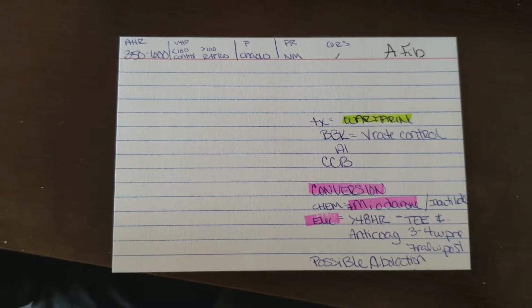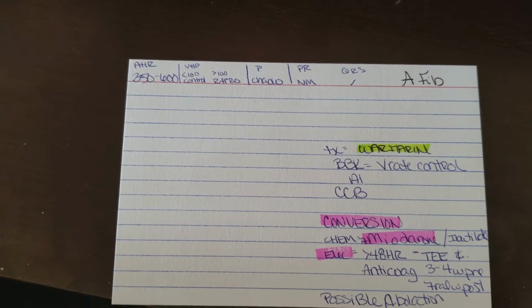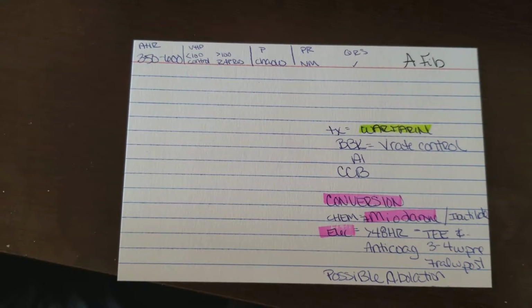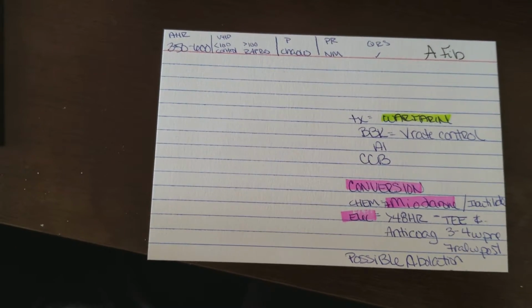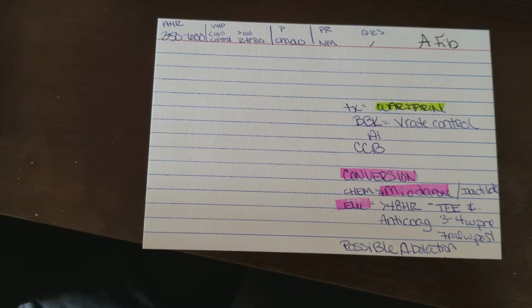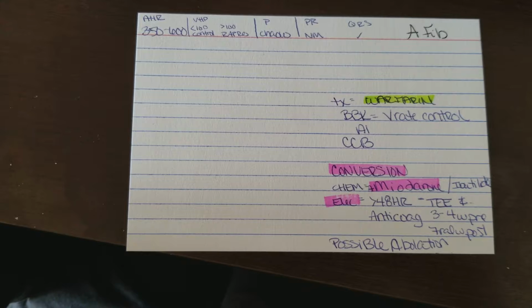Okay, looking at AFib, you're going to have an atrial heart rate of 350 to 600. With controlled, we'll have a ventricular heart rate of less than 100, or rapid response, greater than 100. A fibrillatory or chaotic P wave, non-measurable PR, QRS is normal. AFib is the most common dysrhythmia. It's the atrium firing in multiple spots.